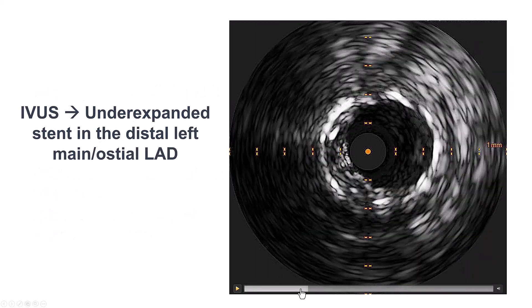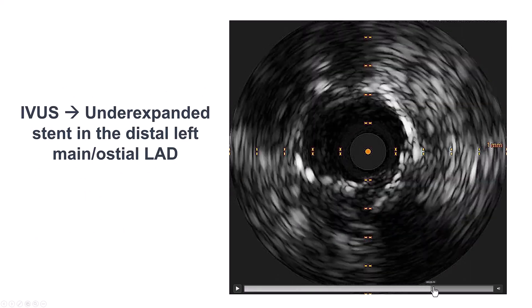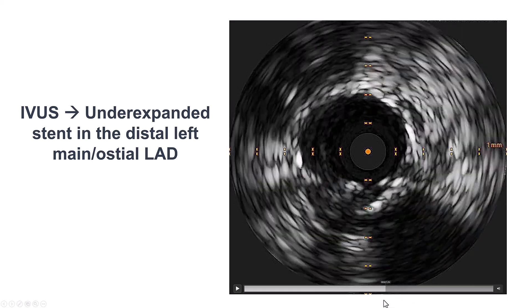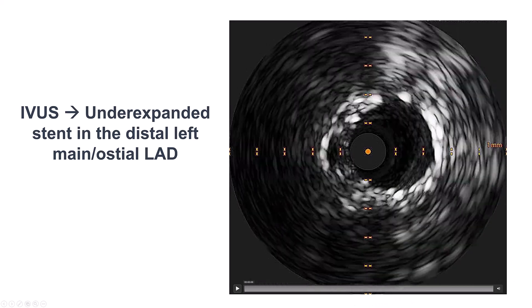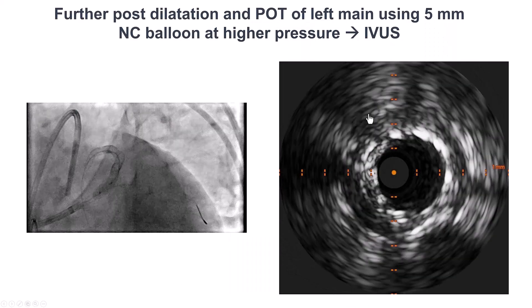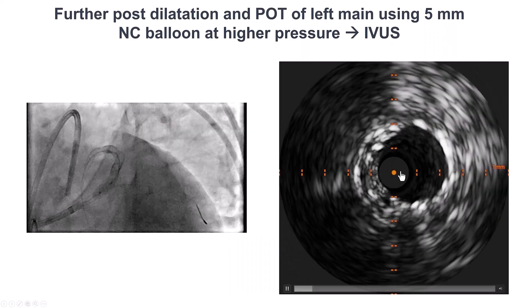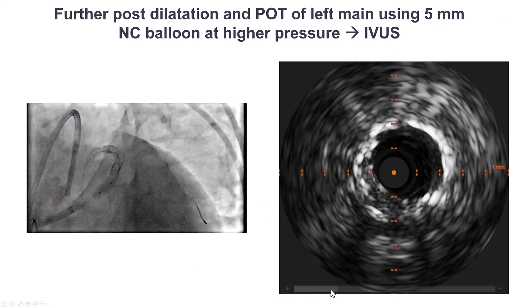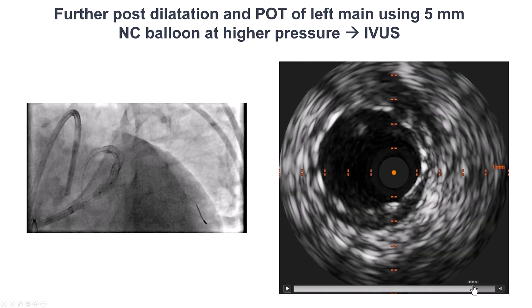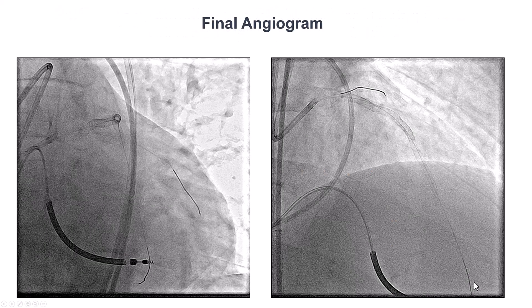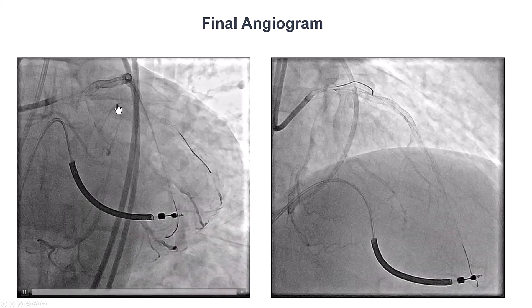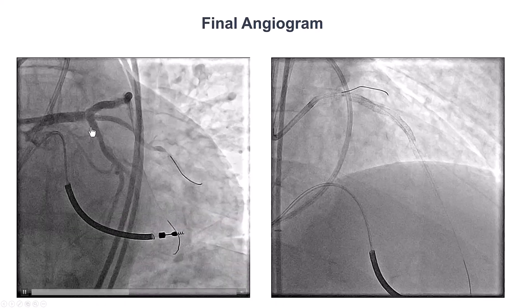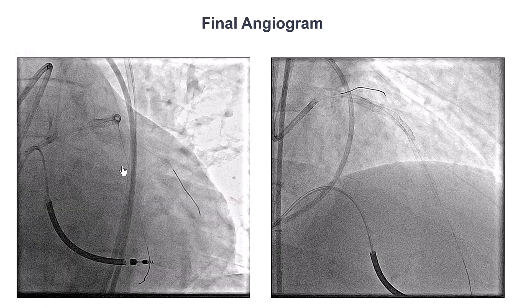IVUS showed that the left main stent was under-expanded in the distal segment. And that is why we ended up using intravascular lithotripsy in an attempt to get it better expanded. This is with a 5.0 mm balloon, and that significantly improved the stenosis of the distal left main. And this is the final angiogram. We have excellent result into the left main as well as the LAD. Even though we jailed the circumflex and the RAMUS, we have excellent flow in both of those branches.